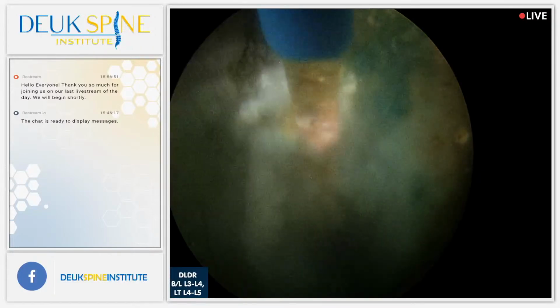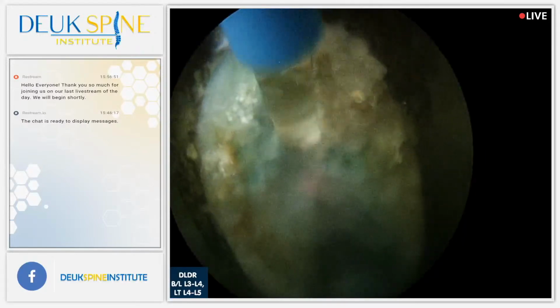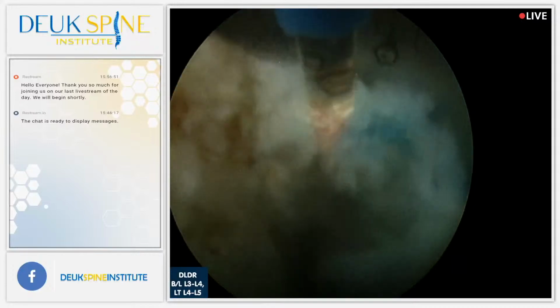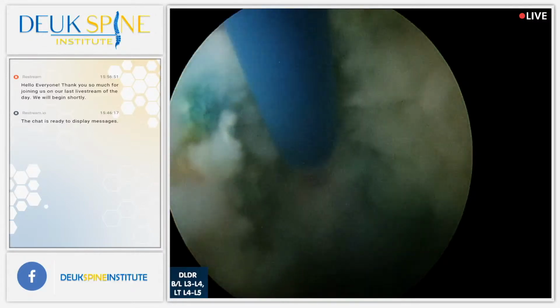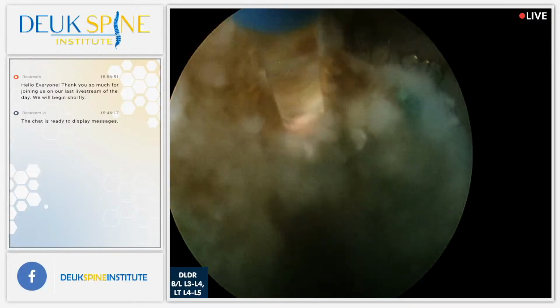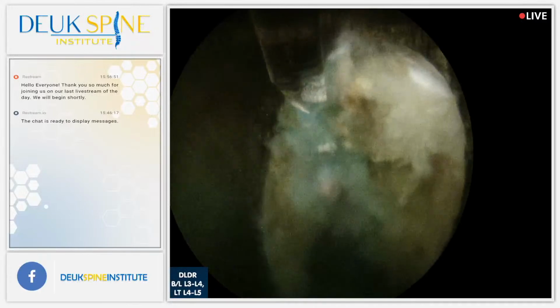I mean, literally plant a needle. Probably using x-ray for me, not ultrasound. Patel likes ultrasound. I think the x-ray would be fine because I'm aiming for a different target than him. He's aiming for the muscle belly. I'm aiming for where the attachment of the muscle is to the femur. It's more of a tendon release, whereas he's doing more of a muscle injection.